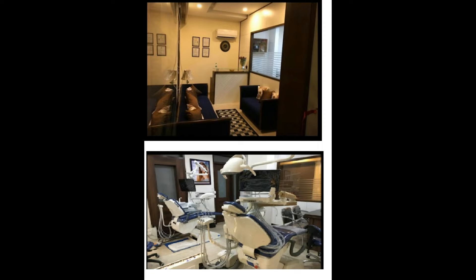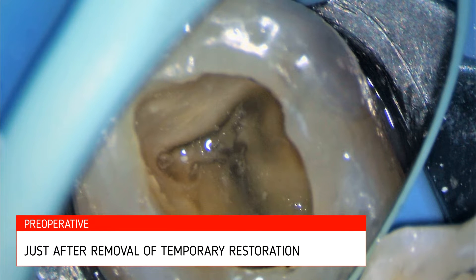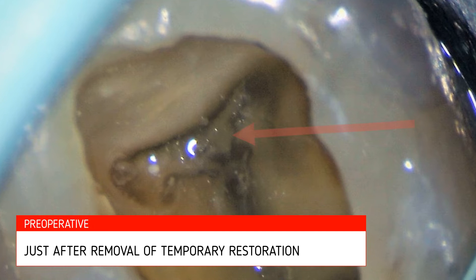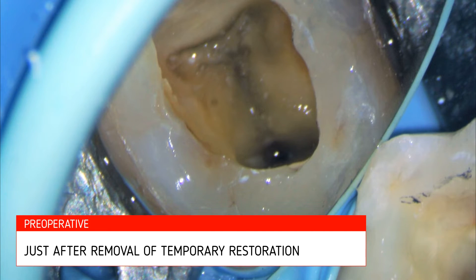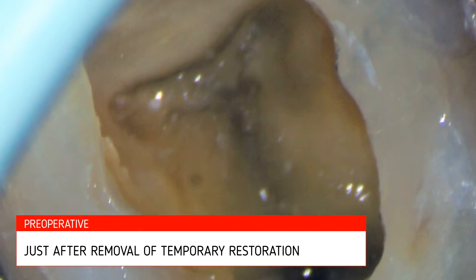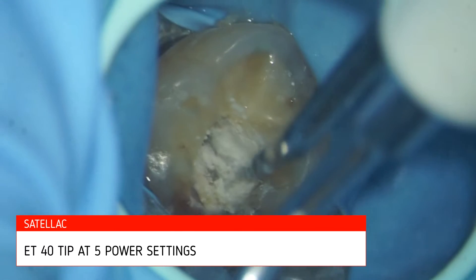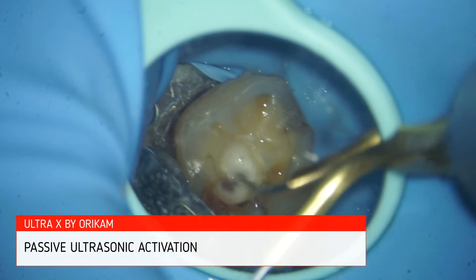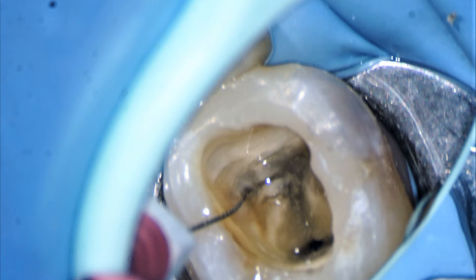Coming back to the case — this is after we remove the temporary restoration. As you can see, this white colored material which is present between the mesial canals is the calcification, the deposits, which makes it very hard to enter into the canal. We use the ET40 tips by Satellac at a low power setting and fine tips by Ultra X to refine the finer stones.